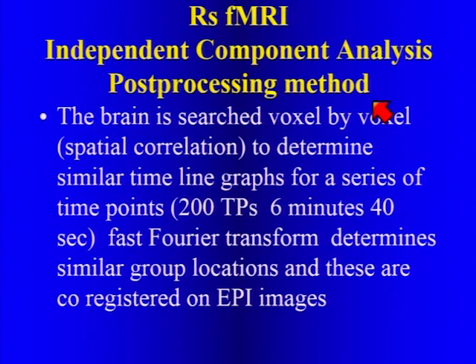So what the resting state does is it samples; we take 200 time points, and we take all of those time points, and then we post-process them together.